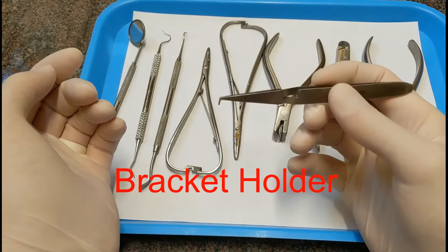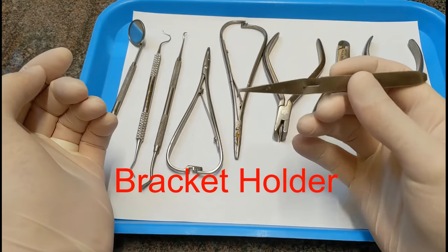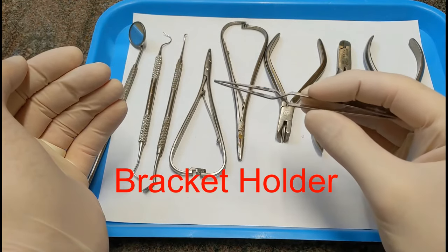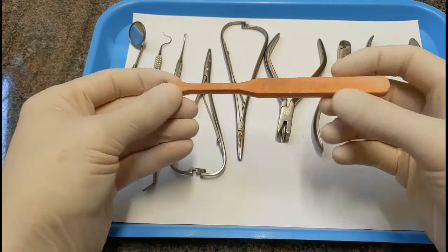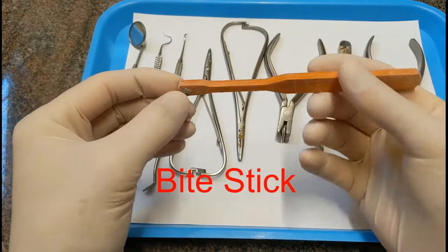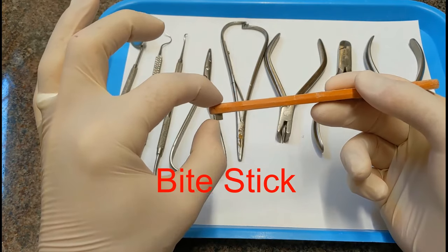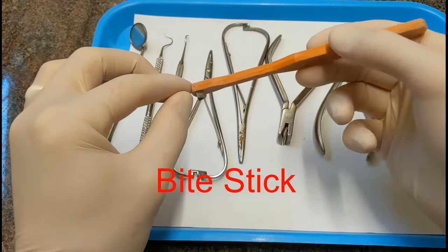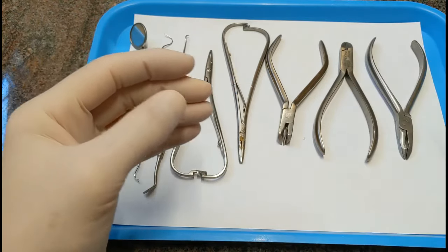This is called a bracket holder. When you squeeze it, it opens; when you let go, it closes. It's for holding brackets when placing them on the teeth — it's called a bracket positioner or bracket holder. This is called a bite stick. If you're seating bands onto the teeth, you put the band on the tooth, position the bite stick on the edge of the band, and have the patient bite down to slide the band onto the tooth. It has a triangular head you can use in different orientations to fit different parts of the tooth.